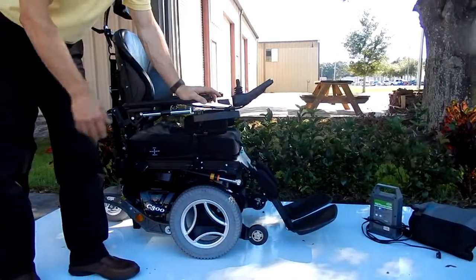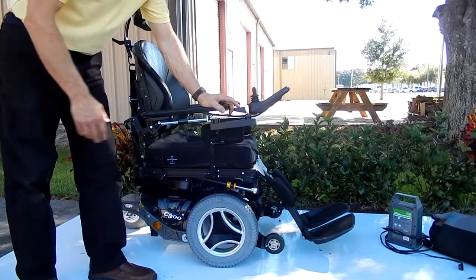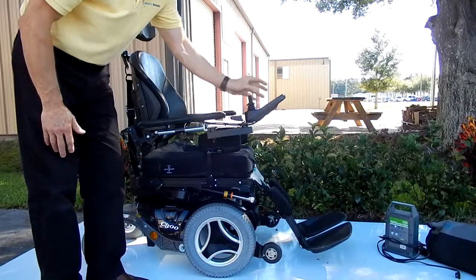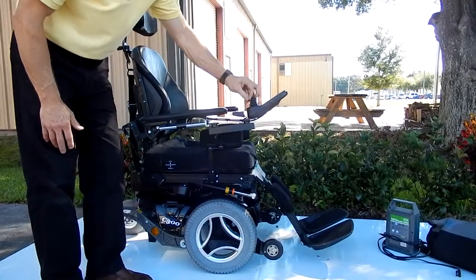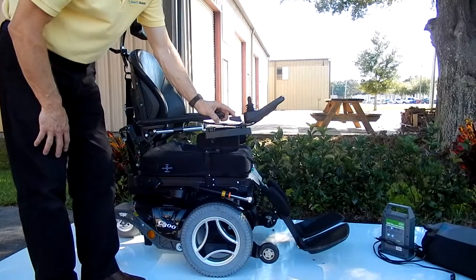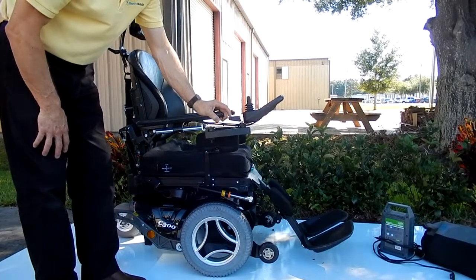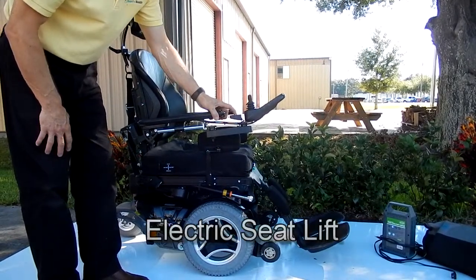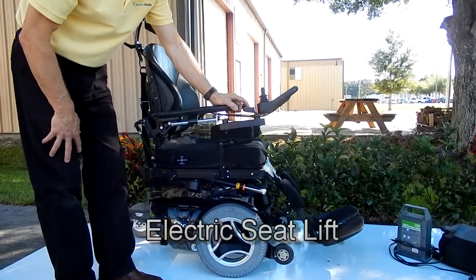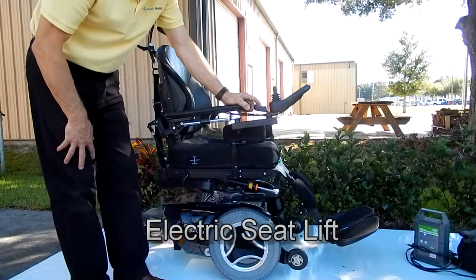The first thing I'm going to show you on this chair is the electric seat lift. You can work the seat lift from the box behind the joystick, or you can program it so you can make it go up and down from the joystick, either way. I'm going to do it from the back of the joystick here. There's your seat lift — this chair has an 8-inch seat lift, very quiet going up.